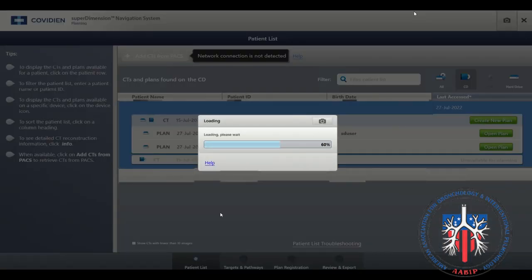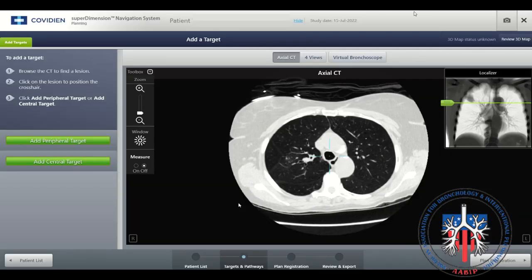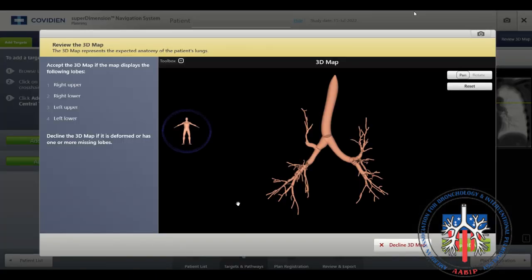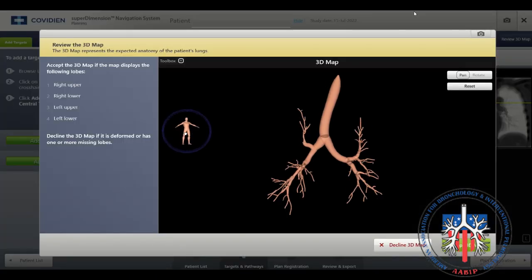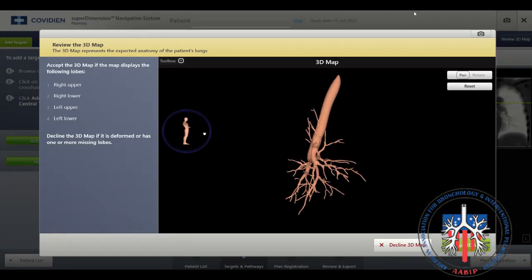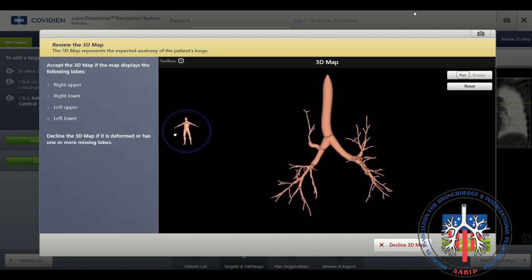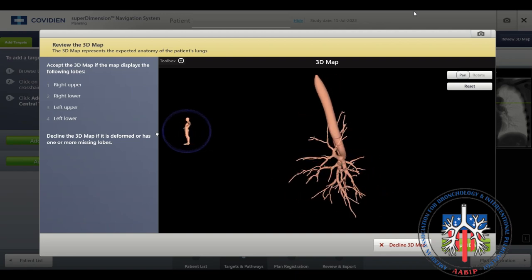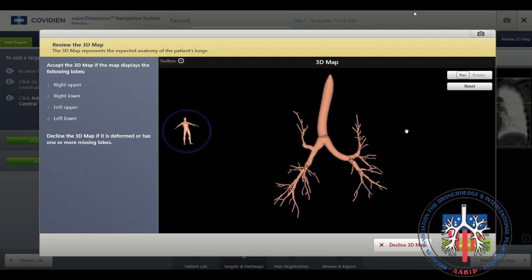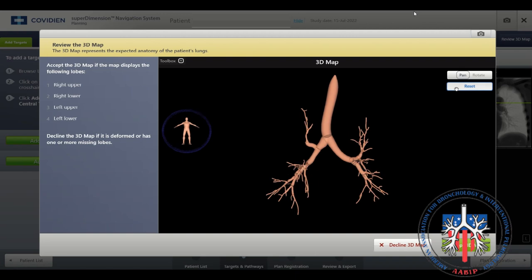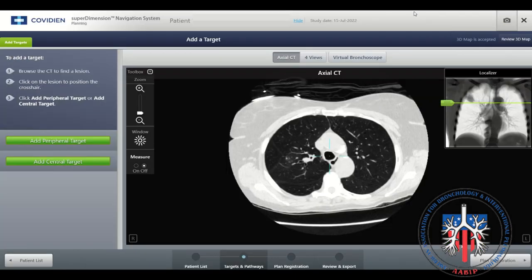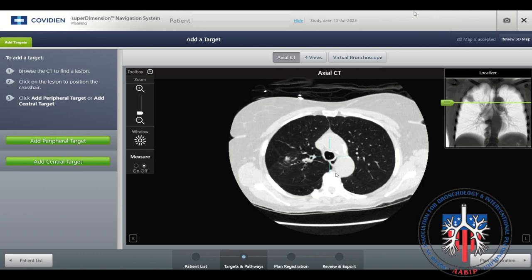Select the Create New Plan option. The planning module will load. You will then inspect the 3D virtual tracheobronchial tree. You can rotate the tree as shown. You will notice that a segment of the right upper lobe is missing on this virtual reconstruction. You can either decline or accept the 3D map. To accept, select the green button in the bottom right-hand corner of the screen.